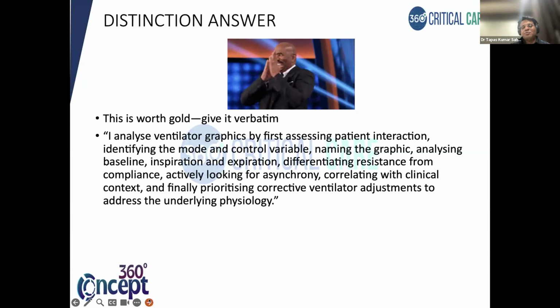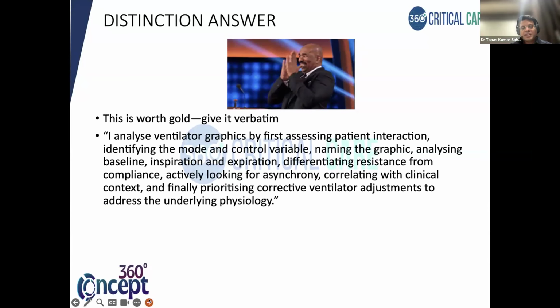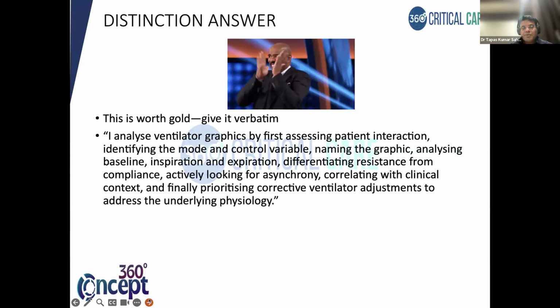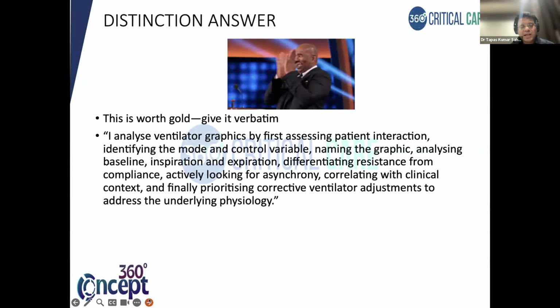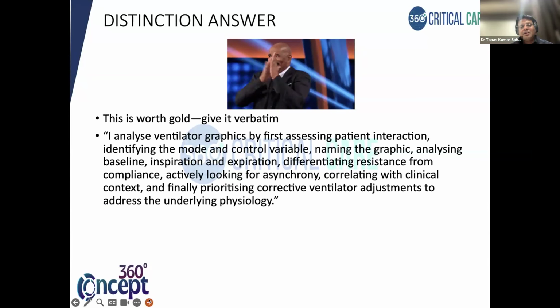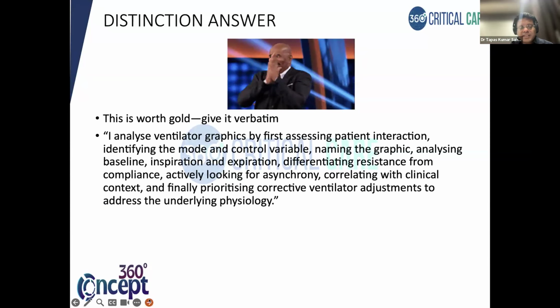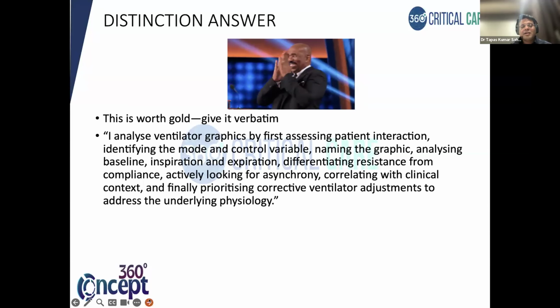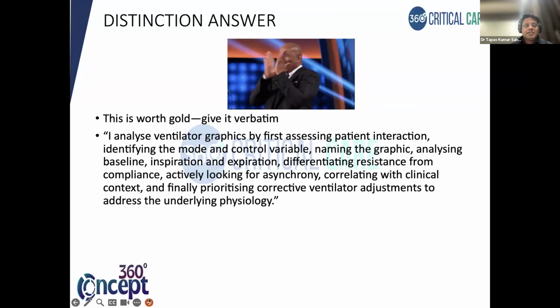If the examiner expects you to tell in complete sentences: I analyze the ventilator graphics by first assessing patient interaction, identifying the mode and the control variable, naming the graphic, analyzing the baseline, inspiration, expiration, differentiating resistance from compliance, actively looking for asynchrony, correlating with the clinical context, and finally prioritizing corrective ventilator adjustment to address the underlying physiology. Oof. This is something the examiner would stand up for.